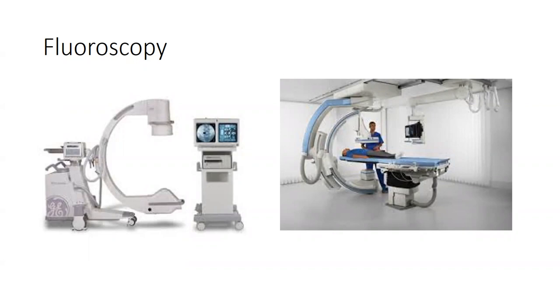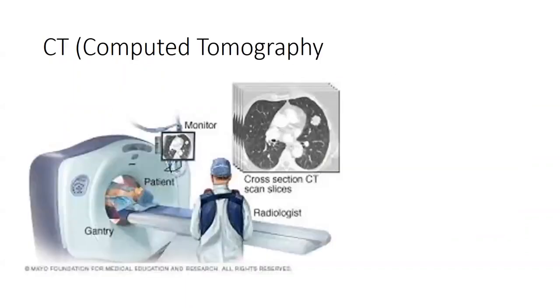All right. So when I do orthopedic procedures and I want to make sure that something moves the way I expect it to, I can actually take fluoroscopy and make sure. Now, we can introduce contrast agents, like we said, and in orthopedics, we will often put iodine in. Okay. So that's fluoroscopy. Now, you're probably all familiar with computed tomography.